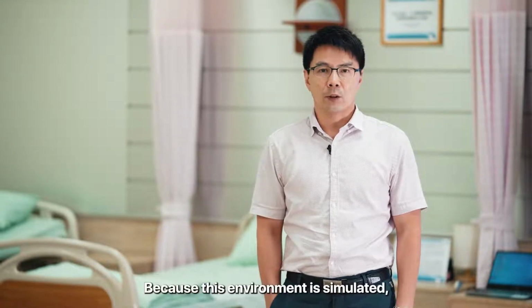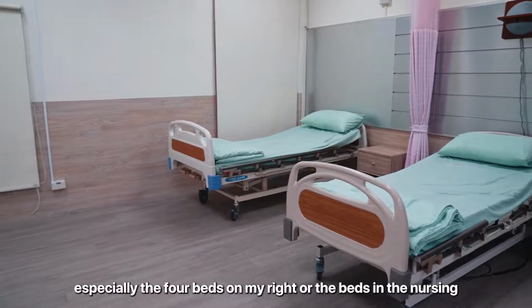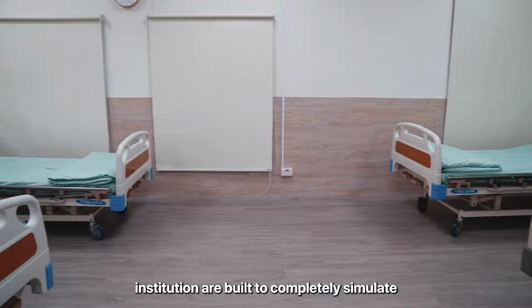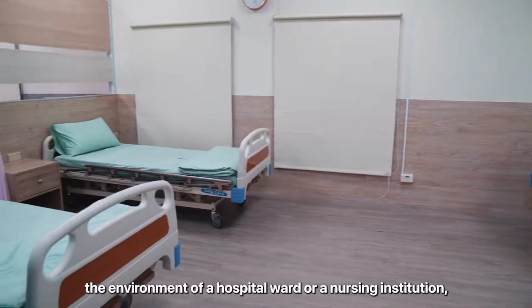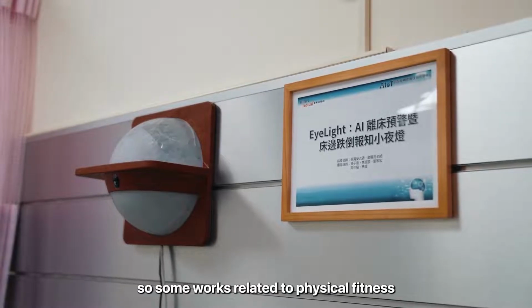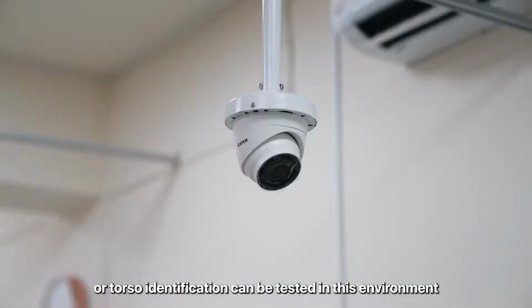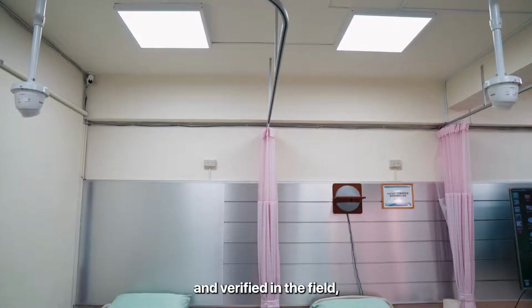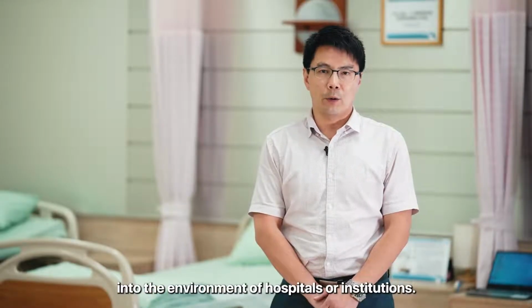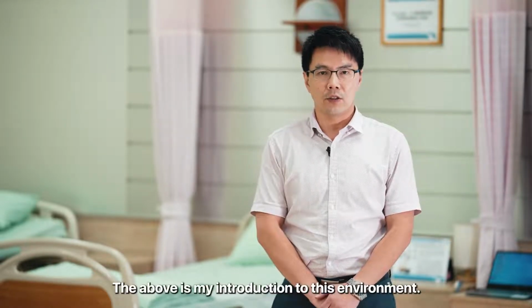Because this environment is simulated, especially the 4 beds on my right, or the beds in the nursing institution, are built to completely simulate the environment of a hospital ward or a nursing institution. So some works related to physical fitness or torso identification can be tested in this environment and verified in the field, and future works can be directly transplanted into the environment of hospitals or institutions. The above is my introduction to this environment.